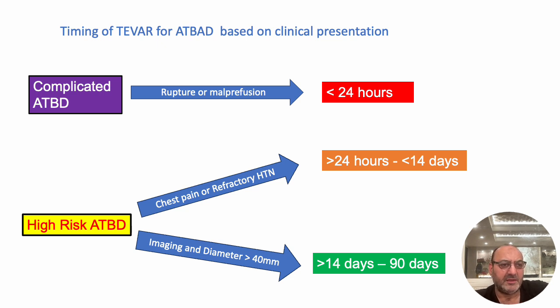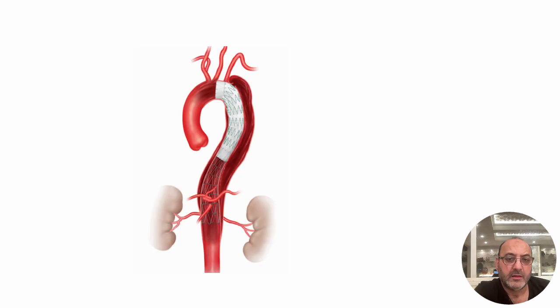It was very nicely put by Dr. Azizadeh, and it's very straightforward, very easy, and I think it's very helpful. Now, briefly, I would touch base on the dissection stent, or composite stent, which is a covered stent on top and an open cell stent at the bottom. The dissection stent is available from Cook right now, and this is a separate talk by itself, but I'm going to touch briefly because it is part of the treatment for acute aortic dissection, at least currently being done by many.